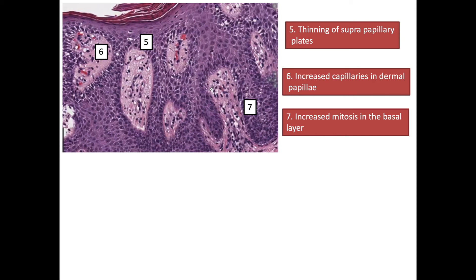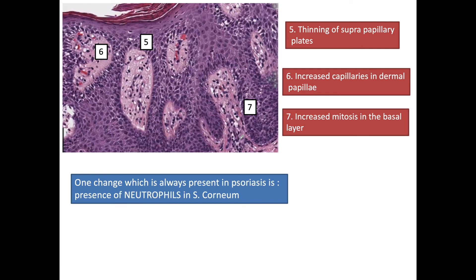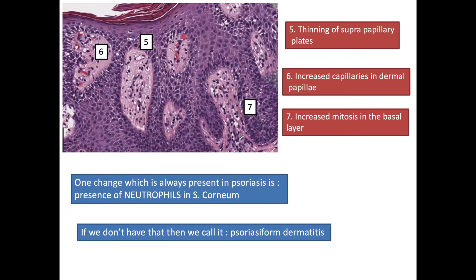In psoriasis, the turnover of keratinocytes is increased, leading to presence of mitosis in the basal layer — this should not be confused with actinic keratosis, which also presents with increased mitosis in the basal layer. We can also see superficial perivascular lymphocytic infiltrate in the dermis. One change which is always present in psoriasis is the presence of neutrophils in the stratum corneum. If neutrophils are not seen in the stratum corneum, we will call it psoriasiform dermatitis and not psoriasis.